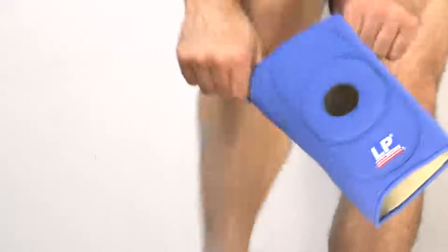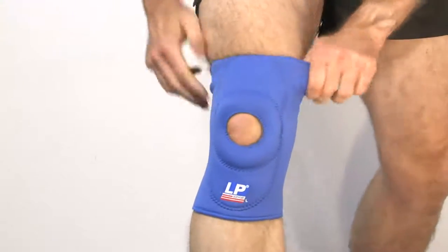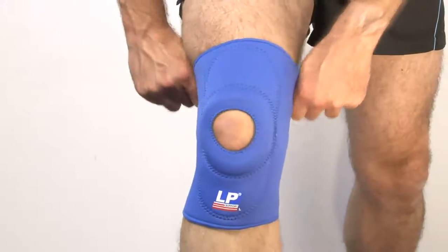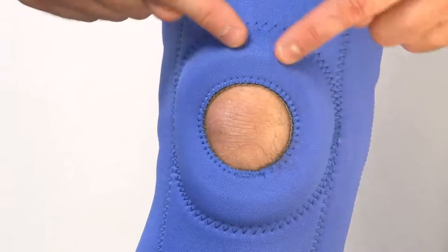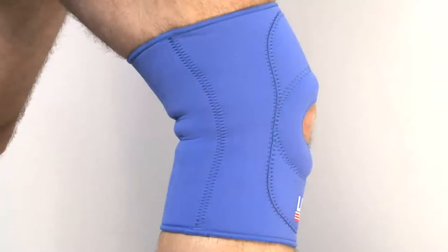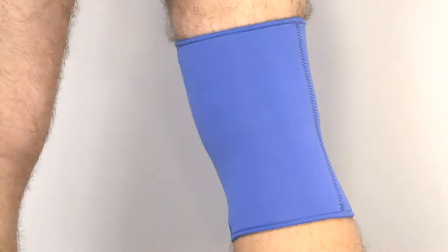The LP Open Patellar Knee Support is designed to help support general knee injuries including strains, sprains and arthritis. It has an open patella to prevent excess pressure on the kneecap. The pull-on style neoprene sleeve provides compression to the knee joint and retains body heat to aid healing.